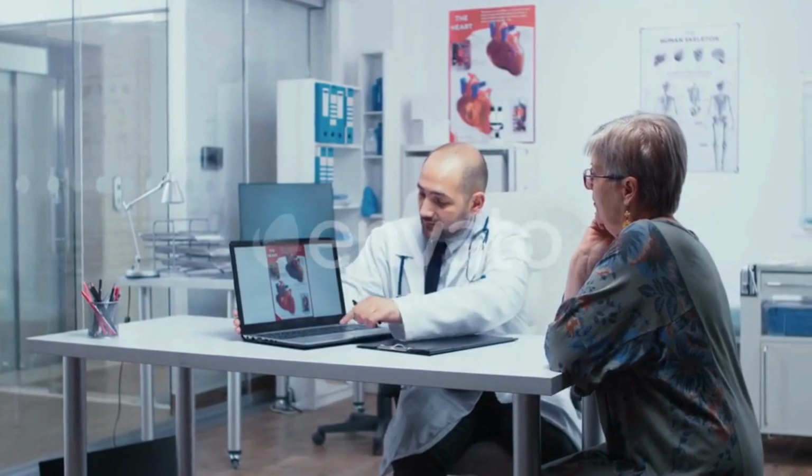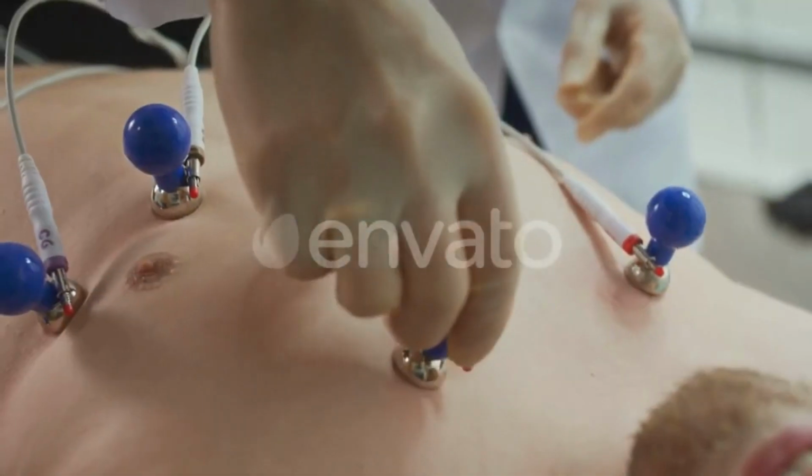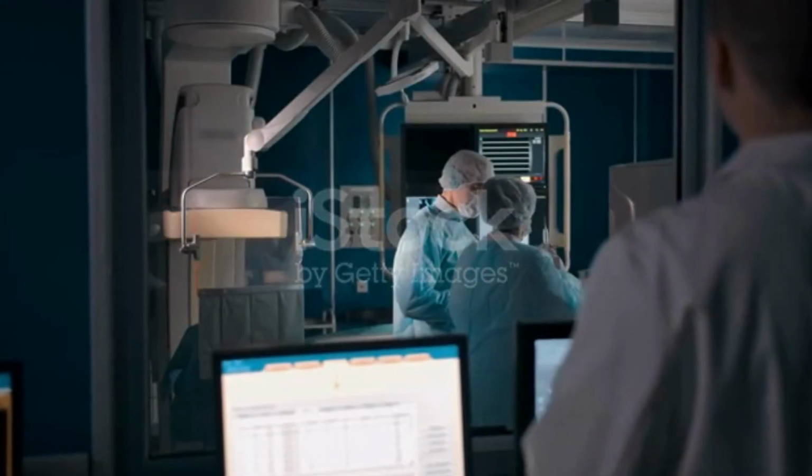Preparing for a coronary angiogram. They will talk to you, examine you, and may do further tests such as blood tests, a chest X-ray, and an electrocardiograph, or ECG. How a coronary angiogram is performed.